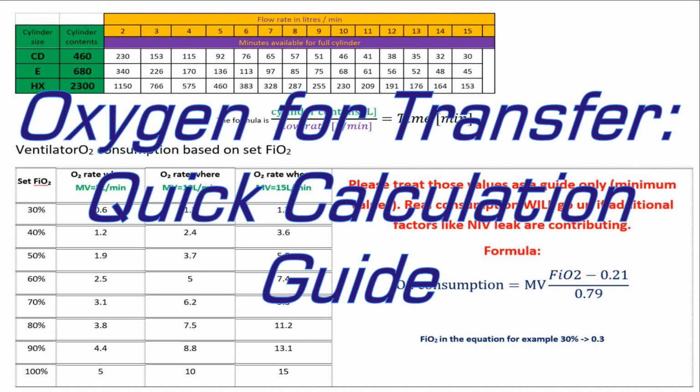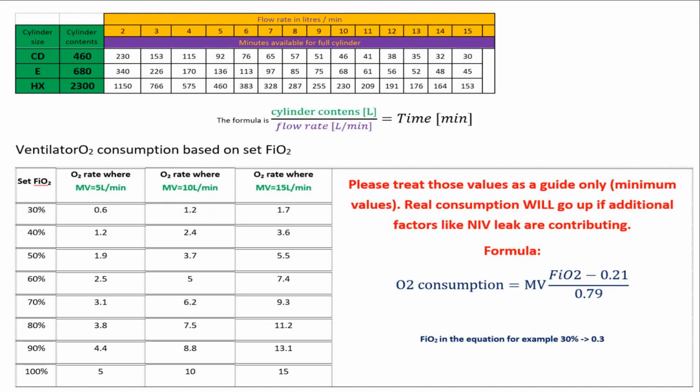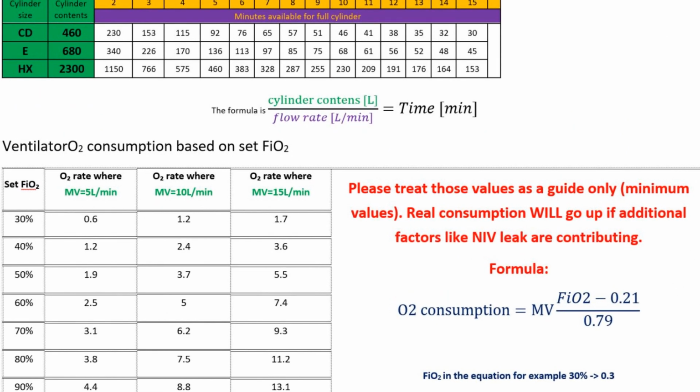Start with the green minute volume. Before transfer, estimate how much oxygen your patient will need. As a rule of thumb, take twice as much oxygen as you expect to use. For example, if a CT trip may take 1 hour, prepare oxygen for 2 hours.